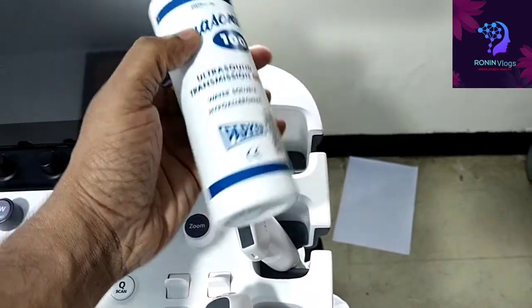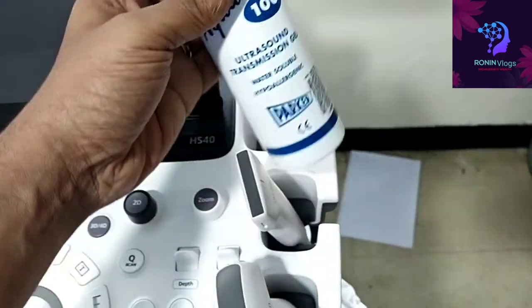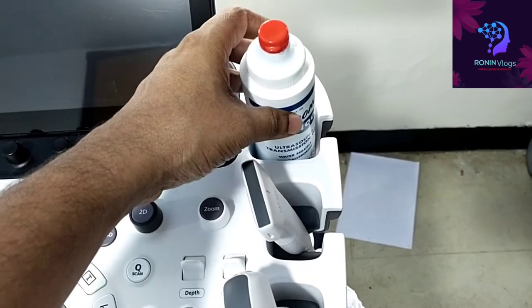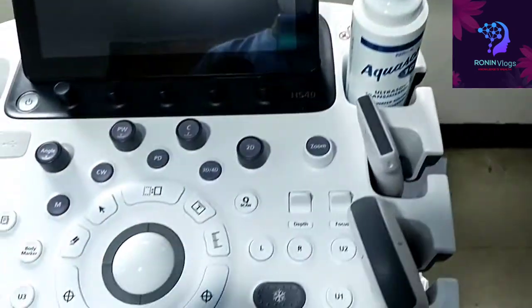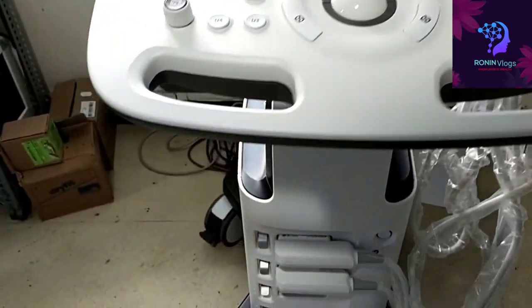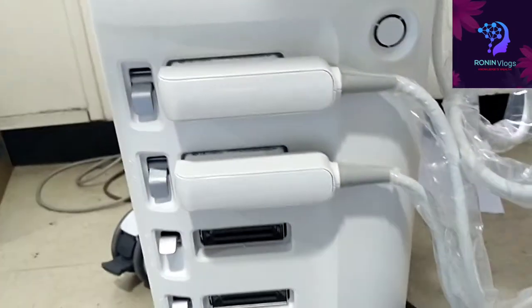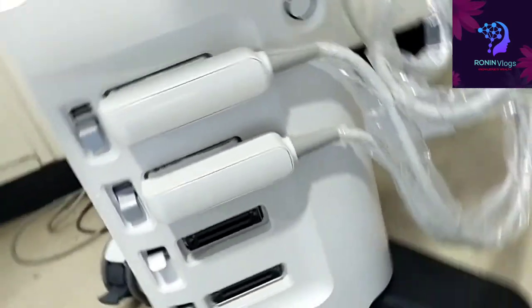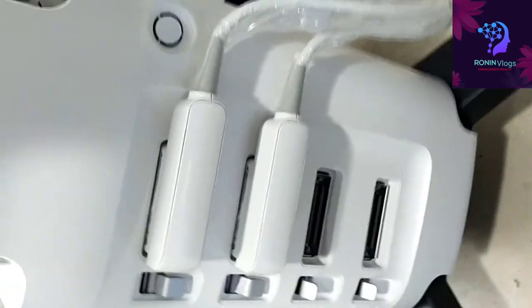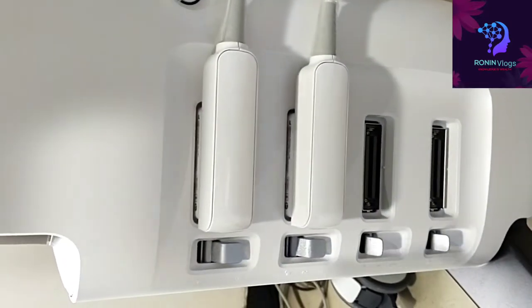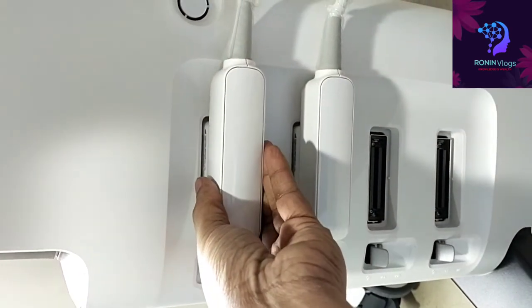This is the gel, ultrasound transmission gel. This is the place where we connect the probes to this machine. We have two probes, but we can connect up to four probes.